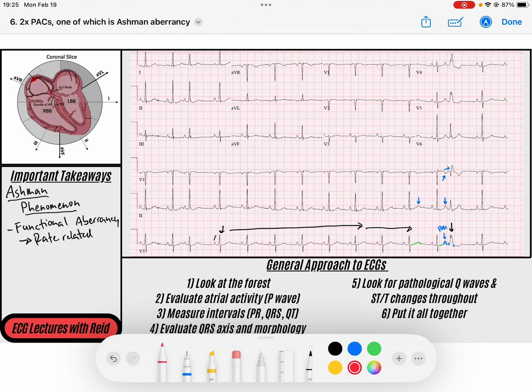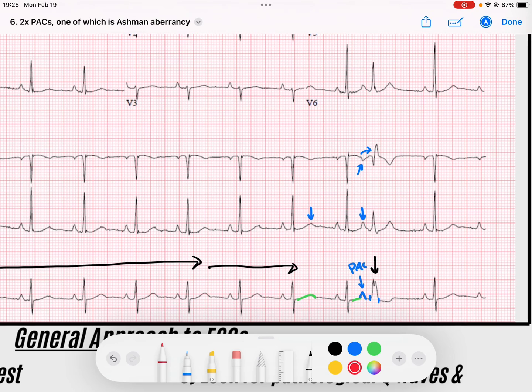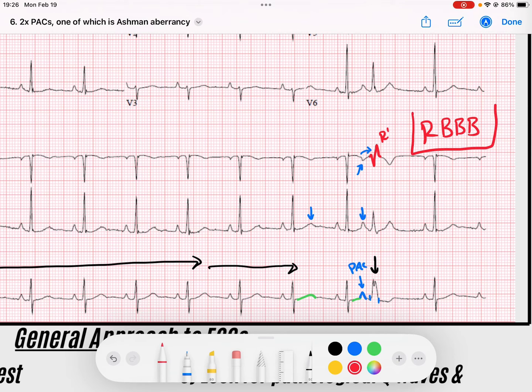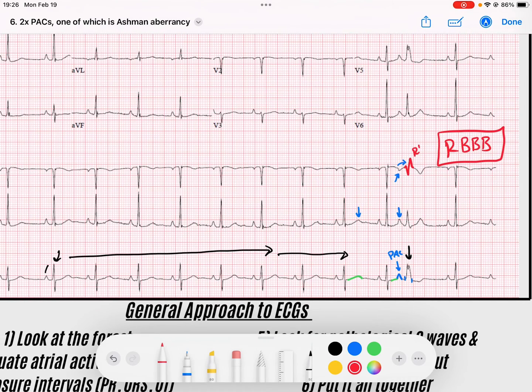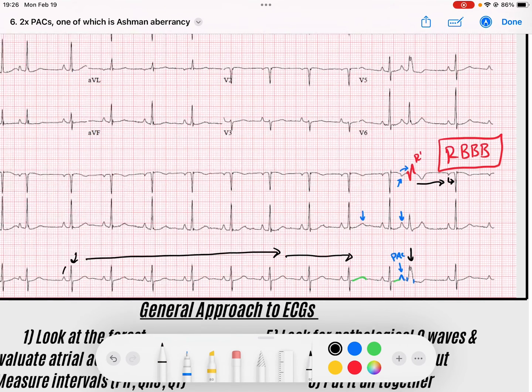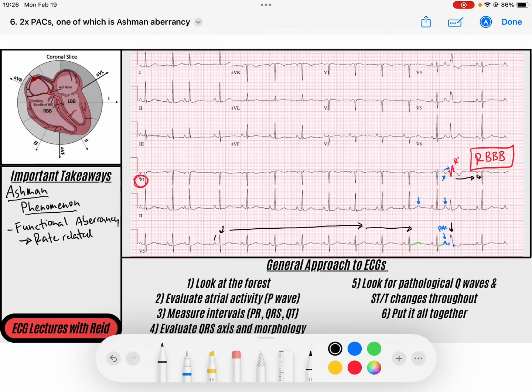Look at this — this is V1. The beat created in V1 has an RSR' morphology — look at that R' morphology. This is a right bundle branch block morphology that we see in V1 after a PAC. That's a perfect example: a premature atrial contraction occurs when the right bundle branch has not yet repolarized, so when the signal is conducted down, the right bundle is functionally blocked for a beat. Then we recover — the next beat is a normal P to a normal QRS. That is a functional right bundle branch block — Ashman phenomenon.